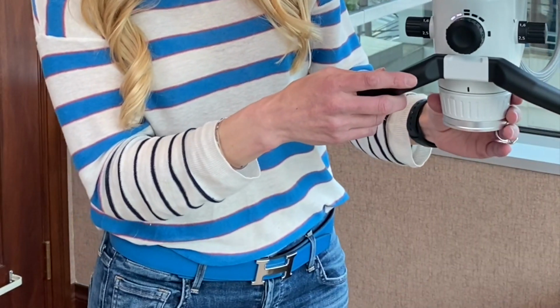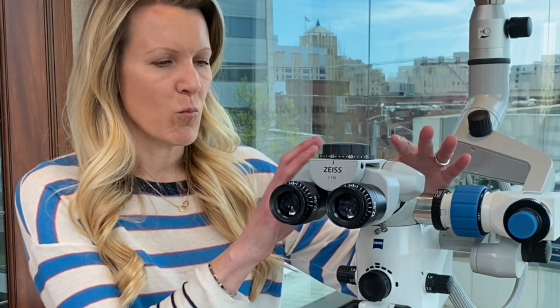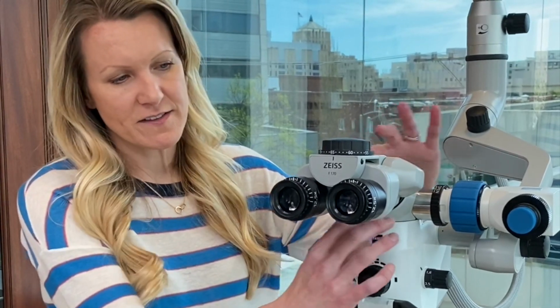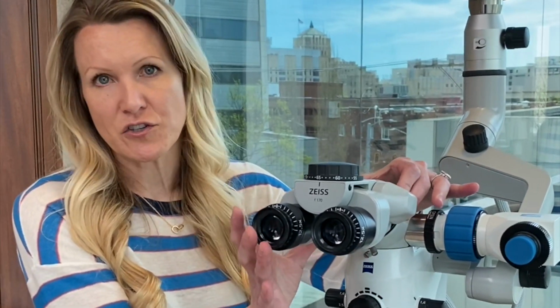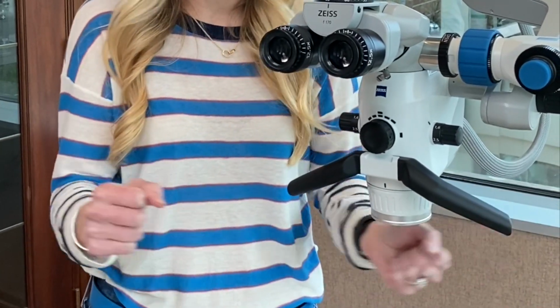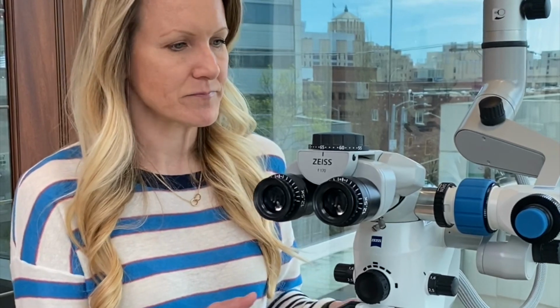Okay, so let's go ahead and turn the light source off and let's talk about components now. Microscopes have a lot of different options for adapters and components and things that you can add to them to really personalize it for your needs. One that's really handy that you will see on a lot of microscopes is called a Mora adapter. And it fits in this midsection here between the binoculars and the body. And what it allows is for this binocular section to remain upright and straight while the lower body will actually swivel back to the right and to the left. And if you can imagine, this is very helpful if you need to get to different parts of the mouth and don't want to compromise your ergonomics.